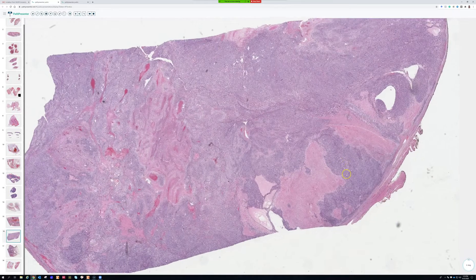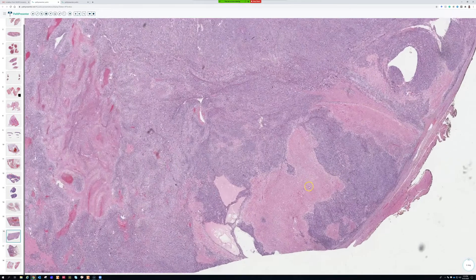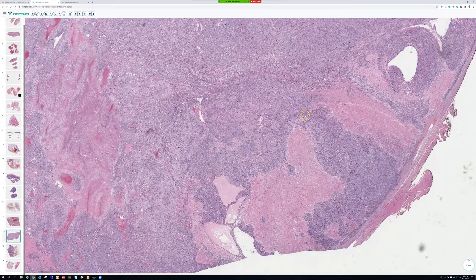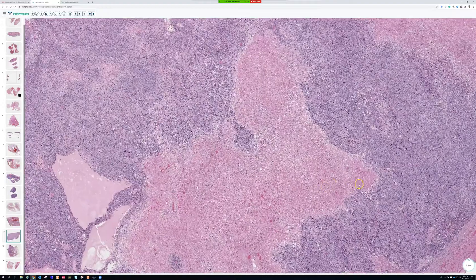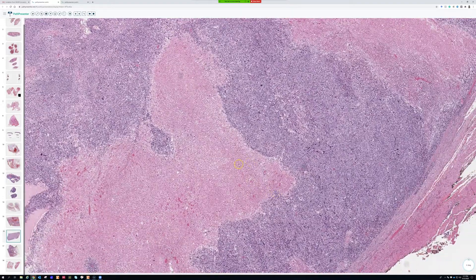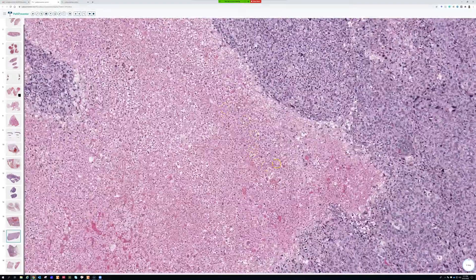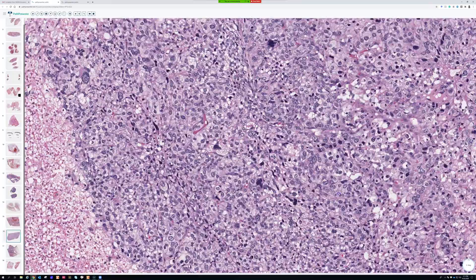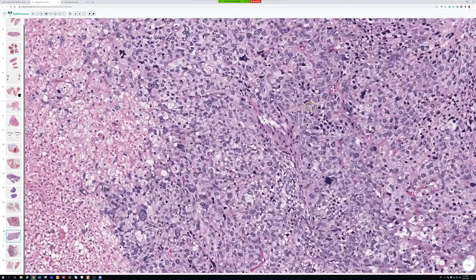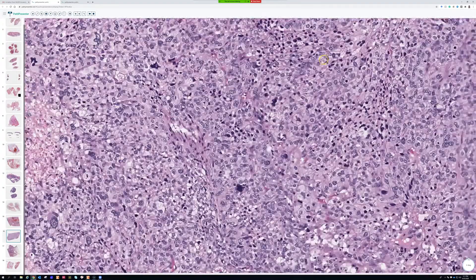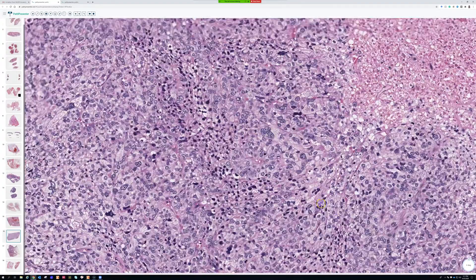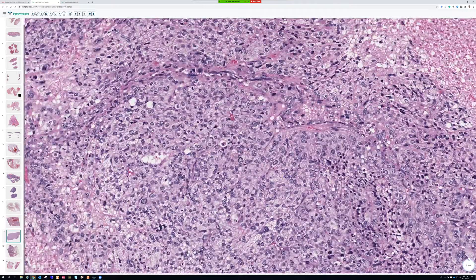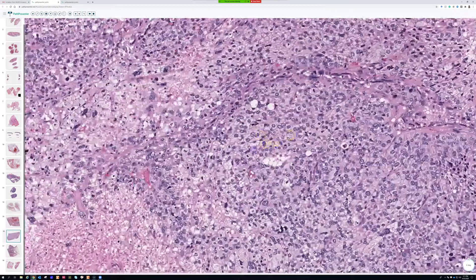This is a pretty good example. At low power, cellular neoplasm with necrosis. Necrosis is malignant 99.9% of the time — that's a beginner rule. There's big zonal necrosis. This is pleomorphic liposarcoma. And it's not spindled, but that's okay.